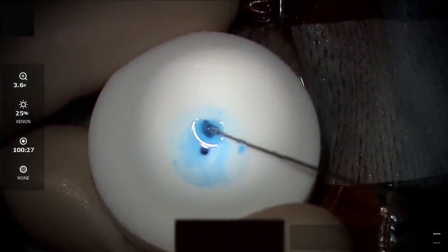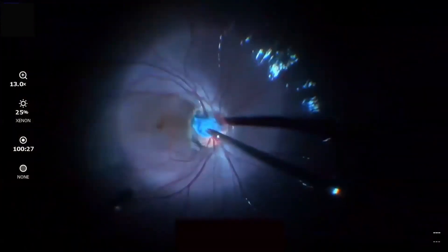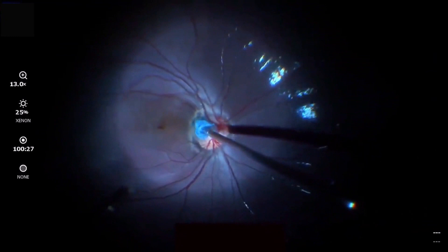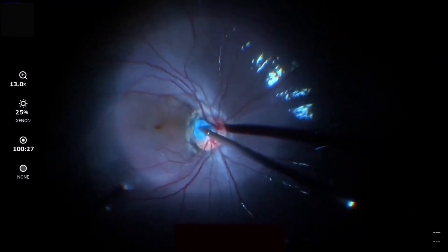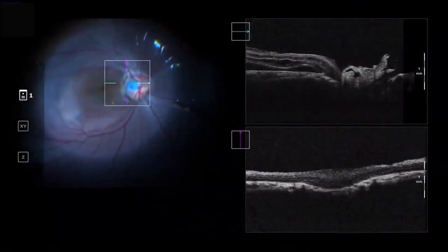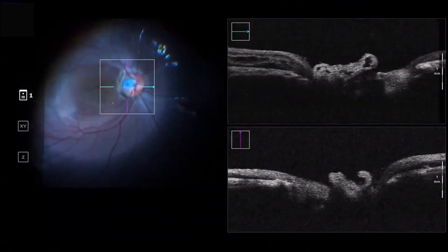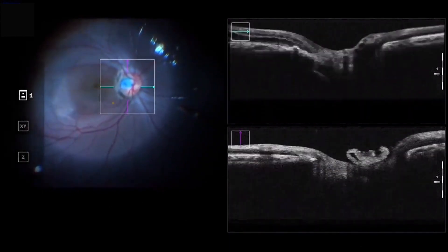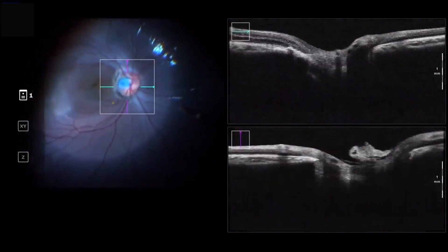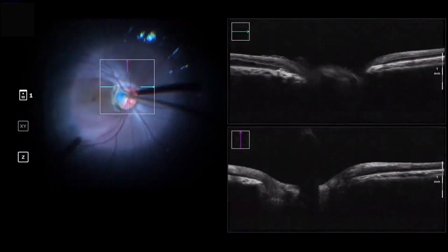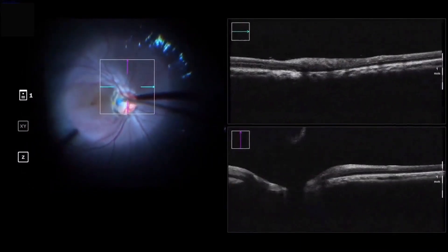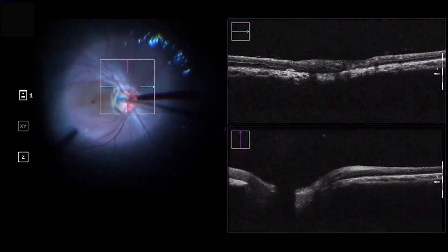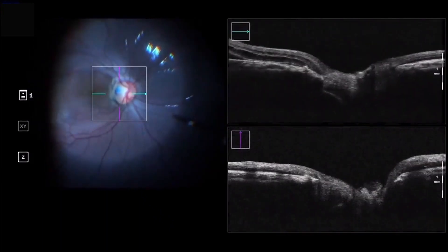After trephination, the graft was stained with brilliant blue, and with the help of intravitreous forceps, the graft was directed into the eye and onto the optic disc pit. The visual feedback offered by the intraoperative OCT and the larger size of the graft was helpful in ensuring a snug fit of the patch graft into the optic disc pit.